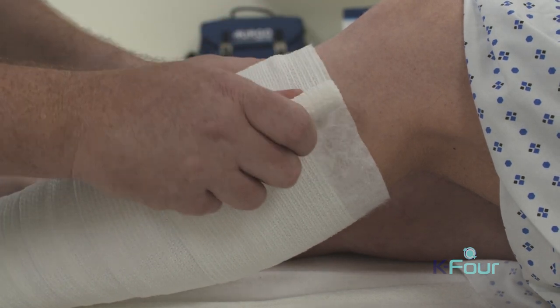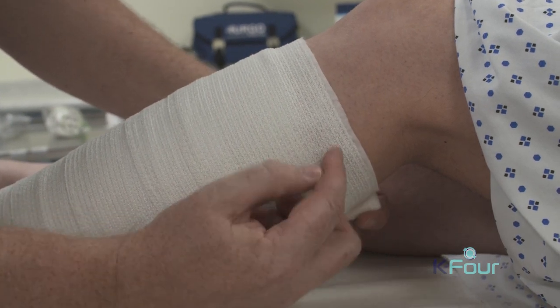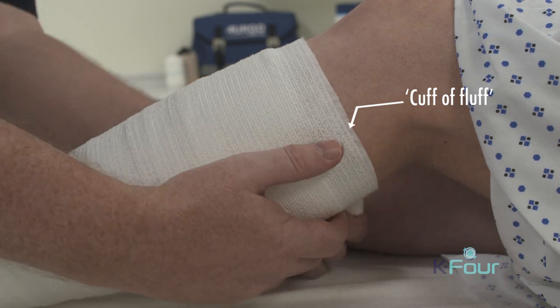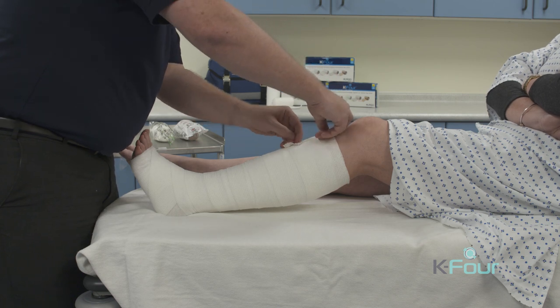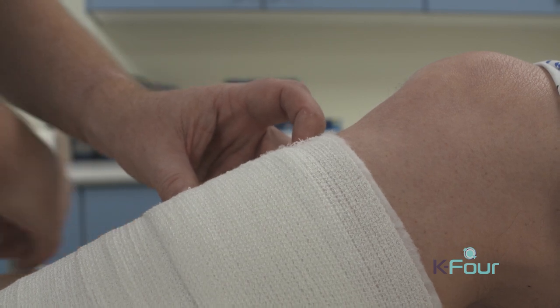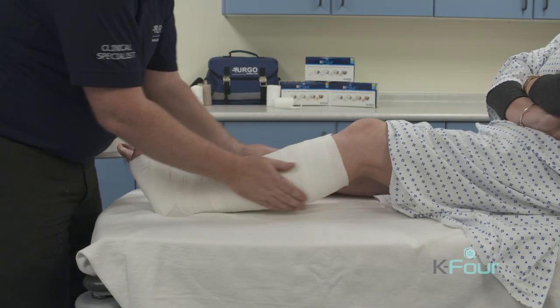When we approach the top of the limb, we slacken off the bandage and leave a cuff of fluff between the top of the bandage and the patient's skin. If we had excess bandage at this point, we would cut that off, as extra layers of bandage would create extra pressure.